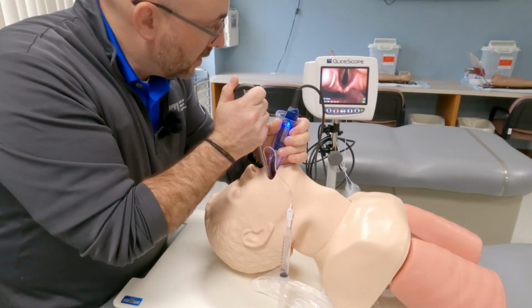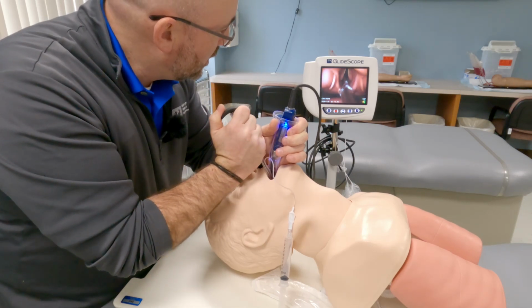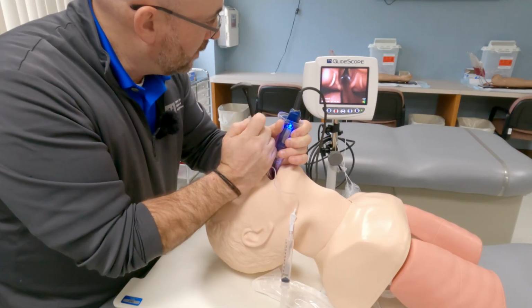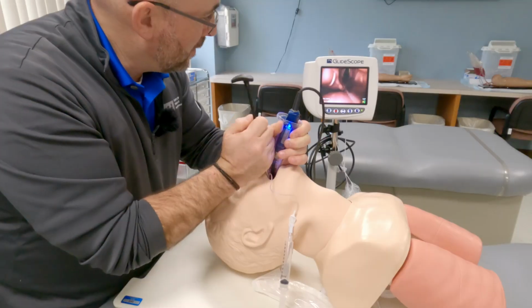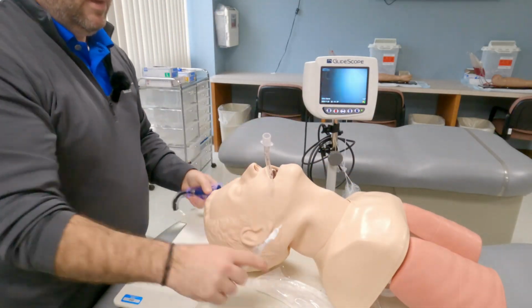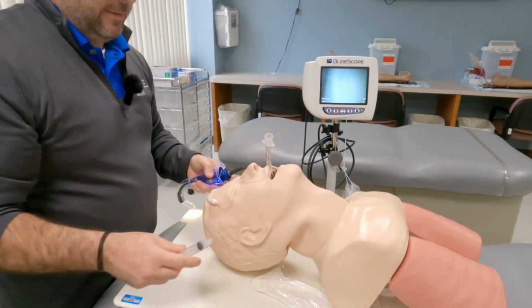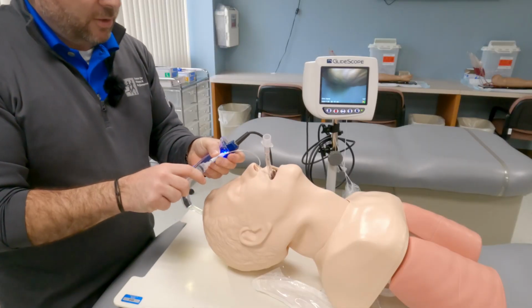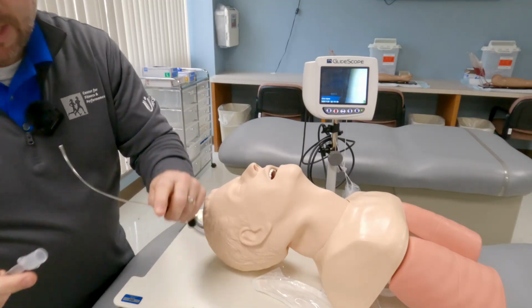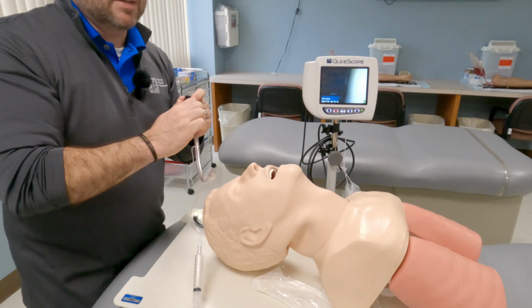Grab the joystick. Step 4, look back at the monitor and adjust, insert, pop, push, pop, push, pull it all the way out towards the chest. Remove, inflate cuff, inflate, and then ventilate. Let me show you real quick what that looks like when we pull the stylet out of the endotracheal tube. And I think this is the number one area that gets missed.